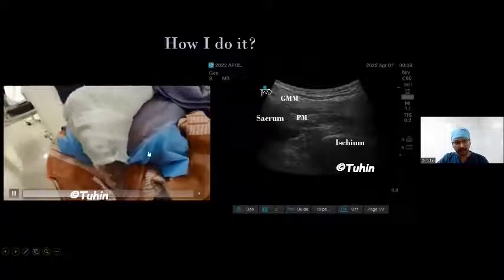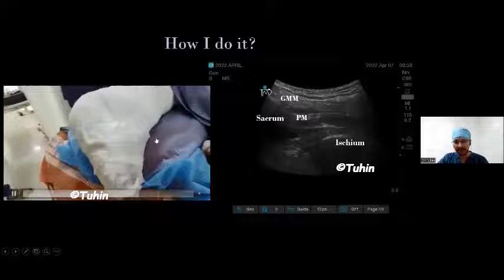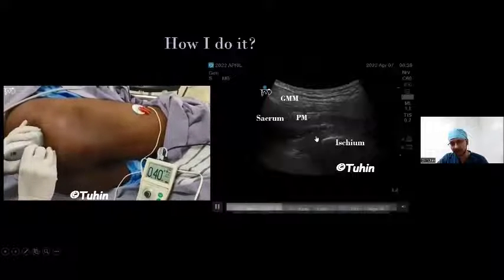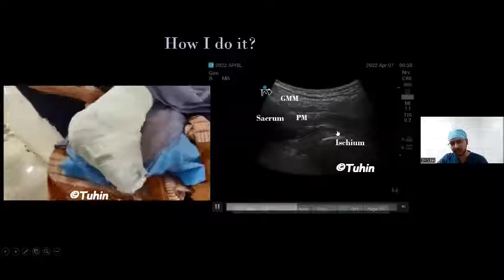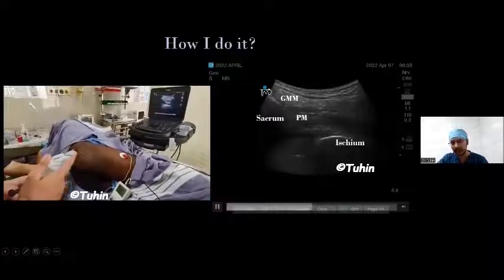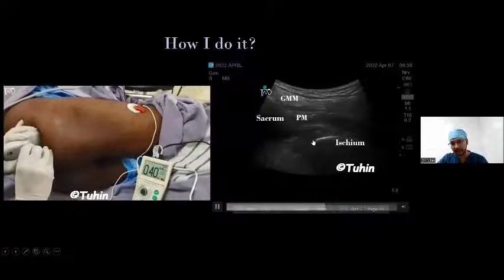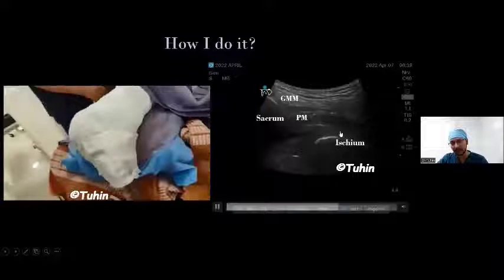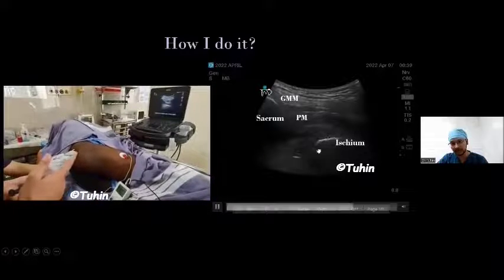with dual guidance. Here you can see we are getting the hamstring contraction that is acceptable at this level. And the moment you inject the drug, you can see a nice spread of the drug inside the paraneural sheath, because the sciatic nerve possesses the paraneural sheath from the beginning itself. And you can see the longitudinal section of the sciatic nerve coming out of the greater sciatic foramen and going over the ischium. You can see here nicely, and surrounding the nerve there is local anesthetic.